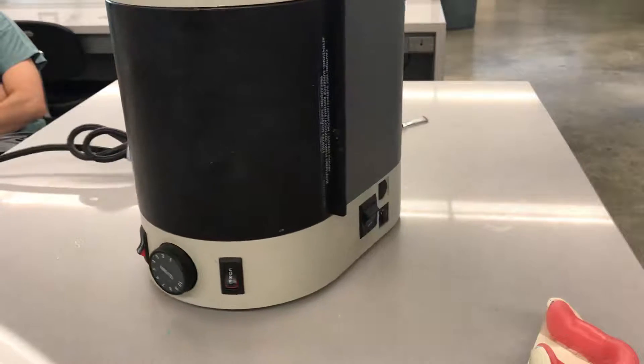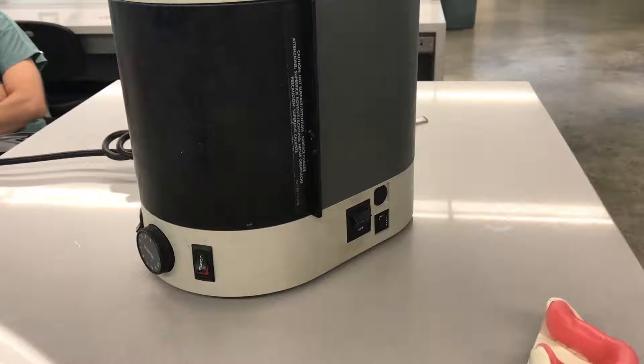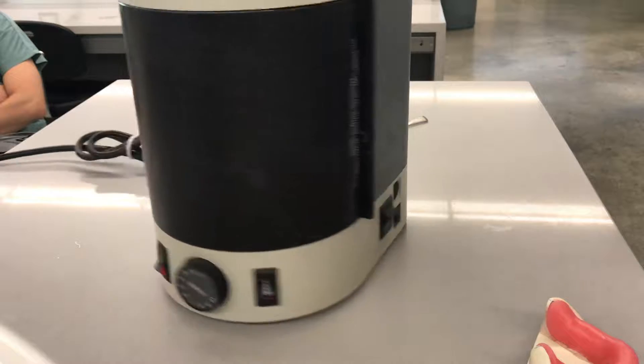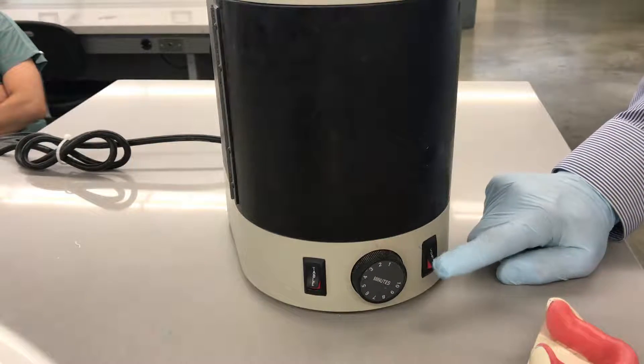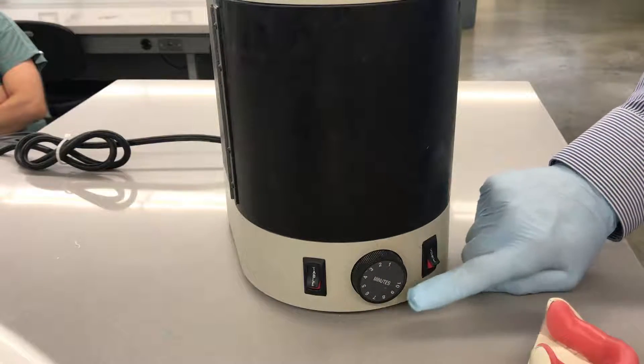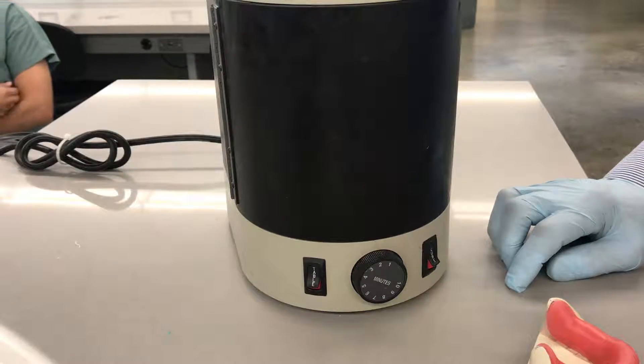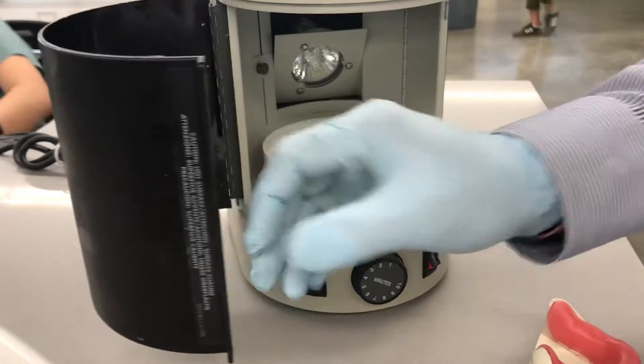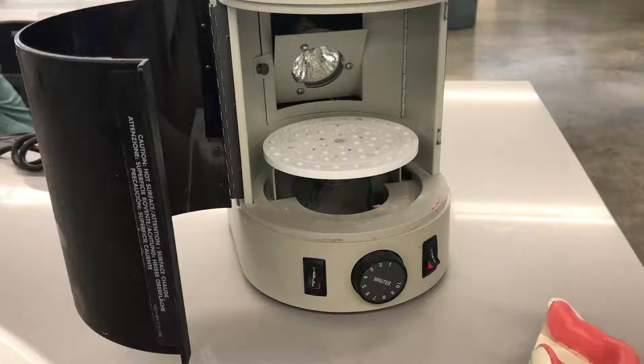You have an on and off button here on the side, as well as one for the light source and one for the turning table. When you open the door, you'll see a table here that is adjustable.